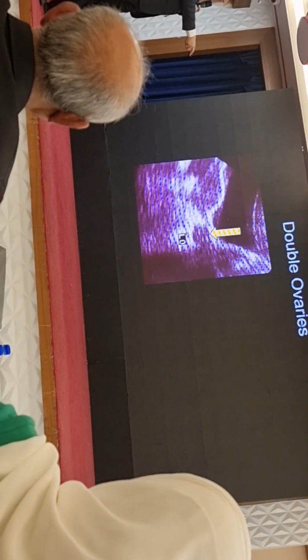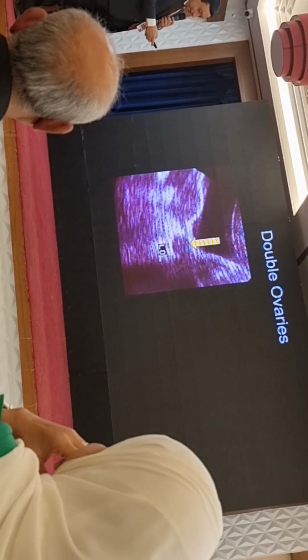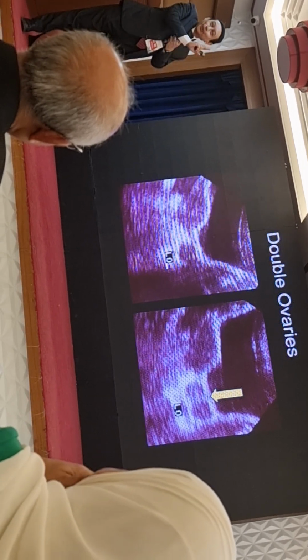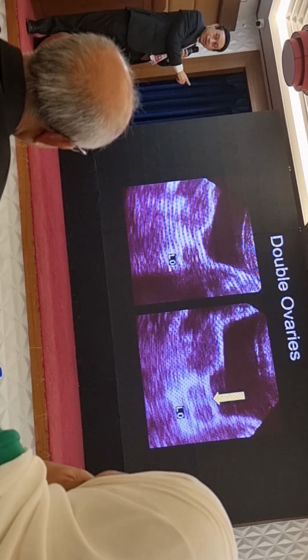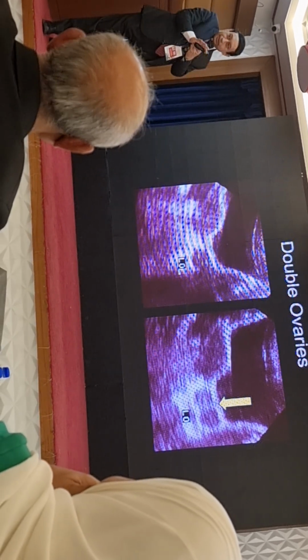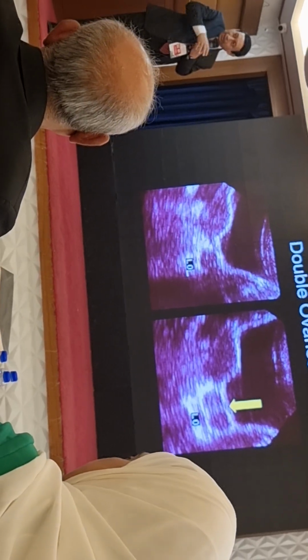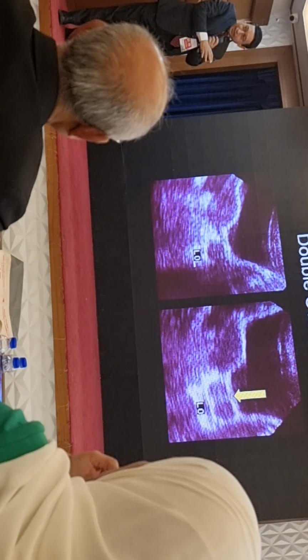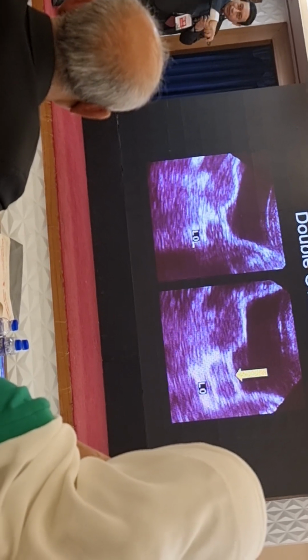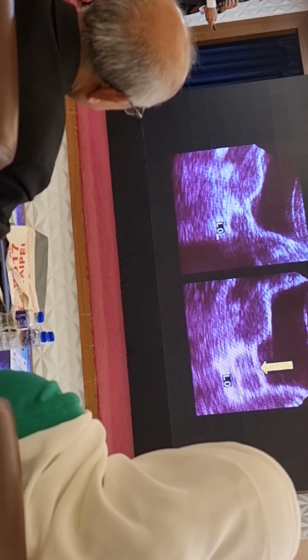And also you can see this is the left ovary, one ovary. But in a different picture, you can see there are 2 ovaries. But actually this is one ovary. So either we change the environment by giving more urine inside or urine outside, or we scan in a different direction, then we will find that this is one ovary.